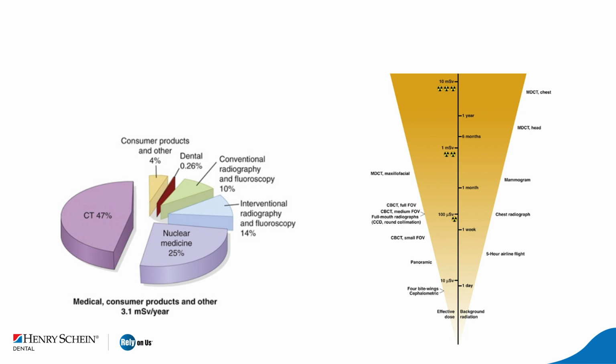So if you are going to give free tickets to your patient, I think they will all accept that and will be very happy to go spend a weekend in LA, or vice versa. If they are in LA, go spend the weekend in New York. But they would not even ask you about radiation exposure, but there is. So when you take a 5-hour flight, it's around 25 microsievert of exposure. So it's very little. And if you need the information, well, just go ahead and take your exam, because you'll see a lot more in detail whatever you are looking for.